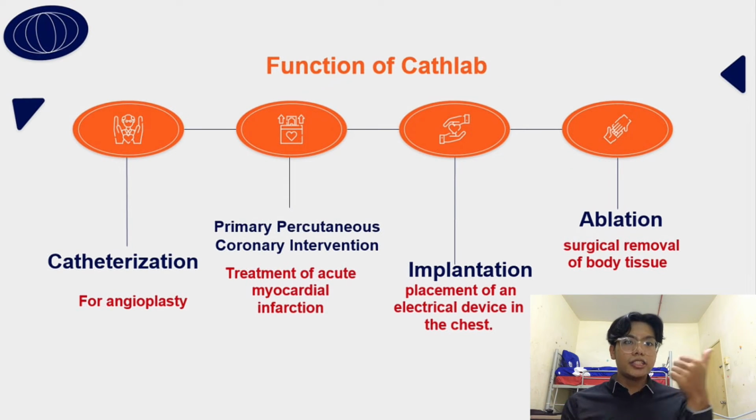Well known is angioplasty, a procedure using a balloon to treat stenosis and blockage. Furthermore, there is primary percutaneous coronary intervention (PPCI), which is a treatment for acute myocardial infarction and also a procedure to treat narrowing arteries.